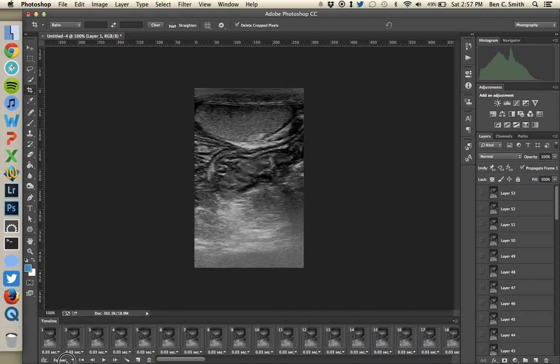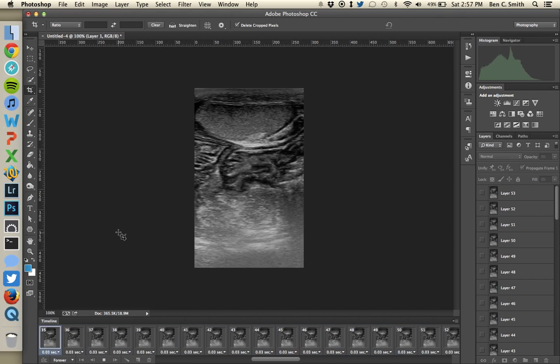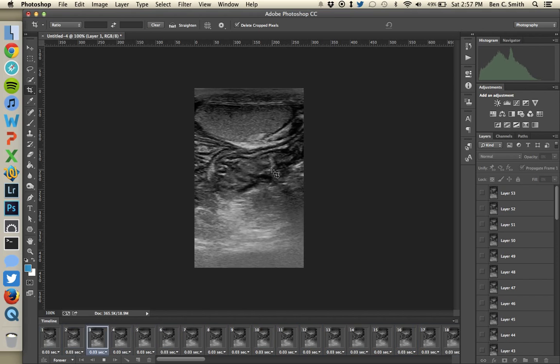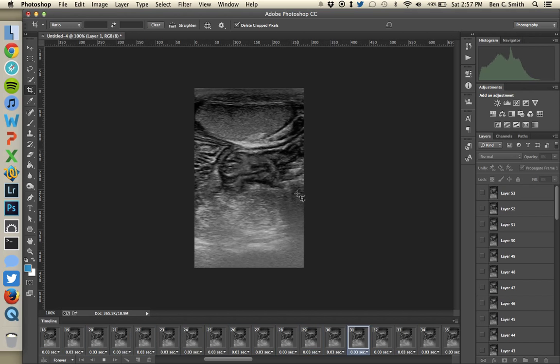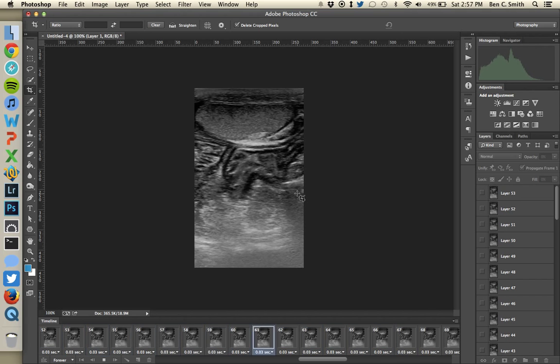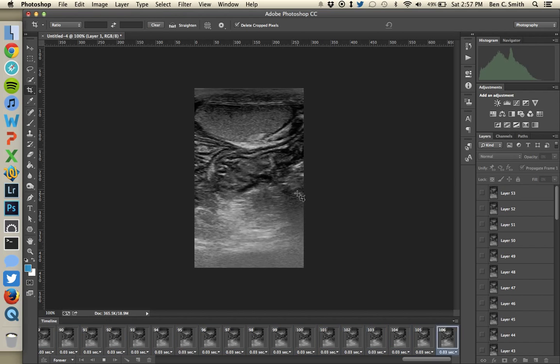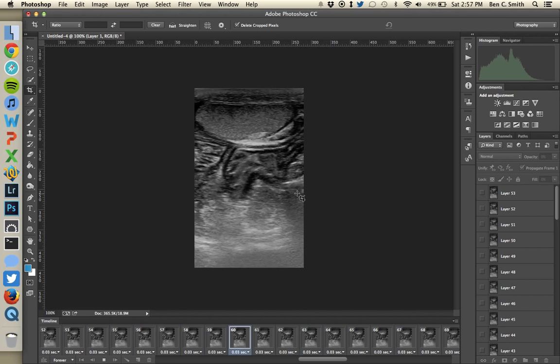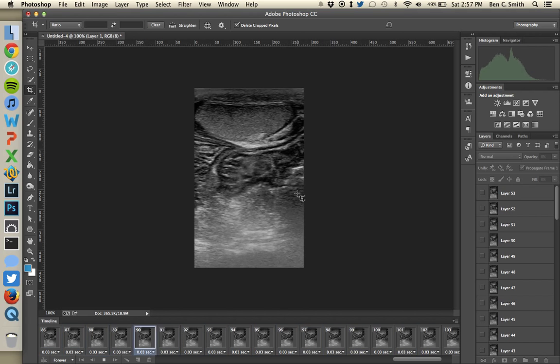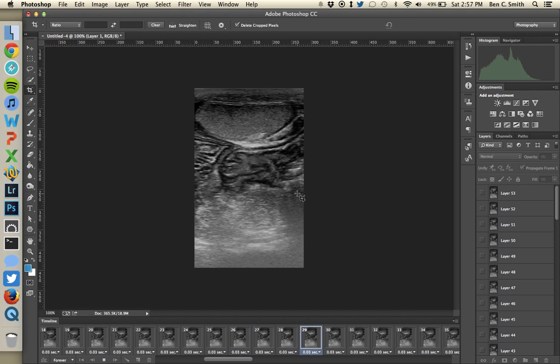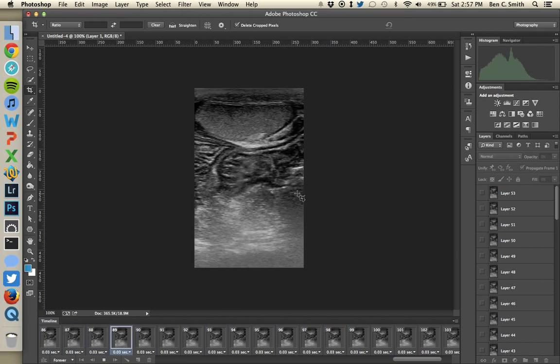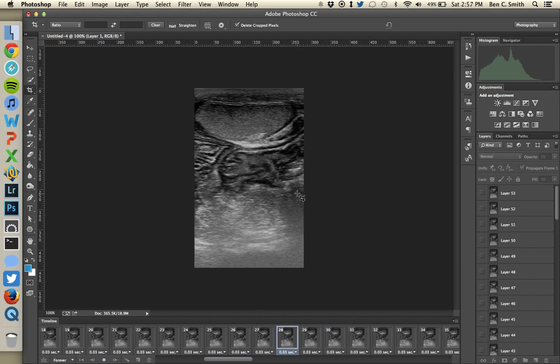Go back to the beginning and preview. Hit the space bar — now watch the animation: the bowel moves in one direction, then reverses and plays back to the beginning, creating a smooth back-and-forth loop with no jump. You can do this with almost any ultrasound clip. It doesn't work well with echocardiograms because the heart appears to beat in reverse — ventricles contracting before the atria — but it works well on anything else that would otherwise look jumpy.